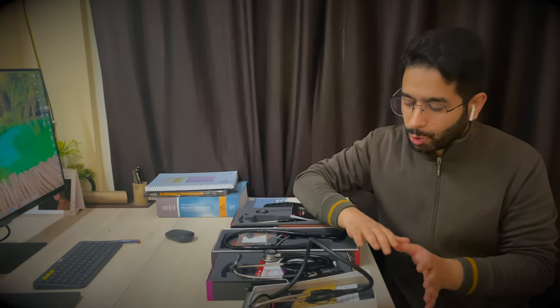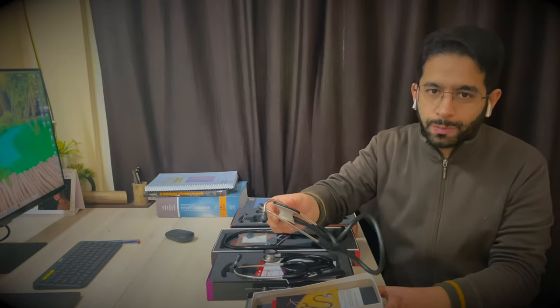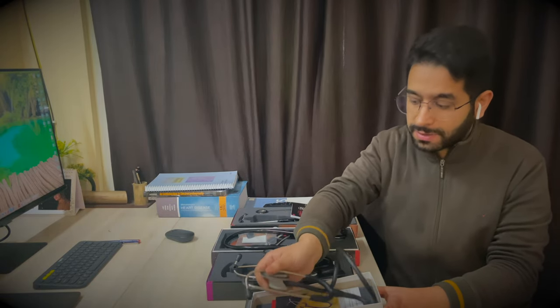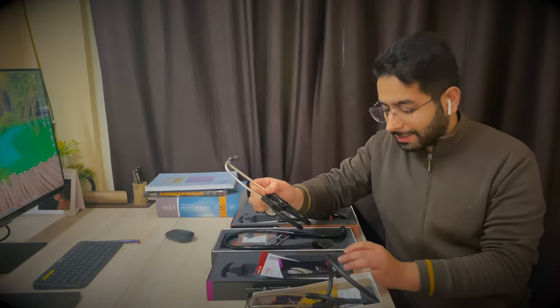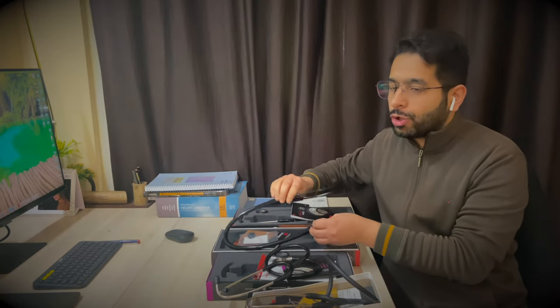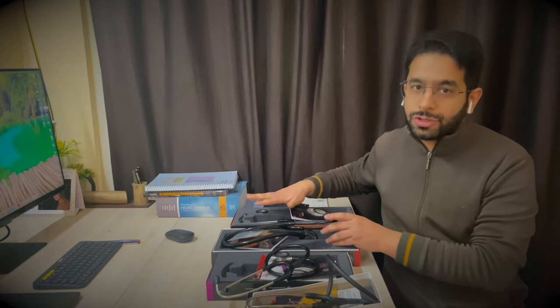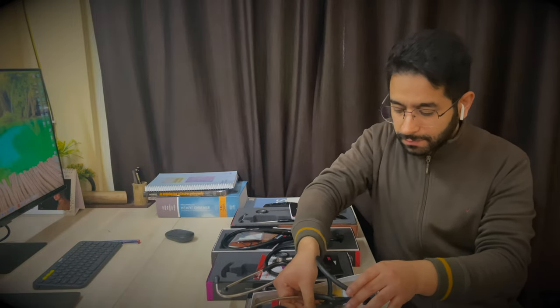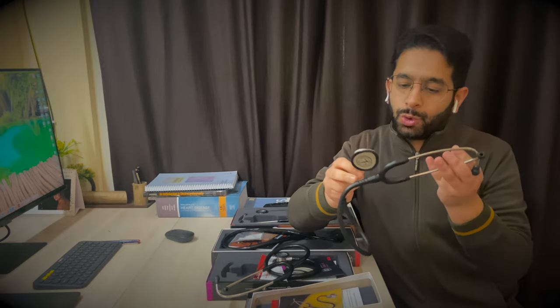Here I have the other three series of Littmann stethoscopes. This is the Littmann Lightweight stethoscope — the lightest and cheapest one. Then this is the Littmann Classic, the routine one which everyone uses. And here I have the Littmann cardiology stethoscopes: the Master Cardiology and the Littmann Cardiology 4.